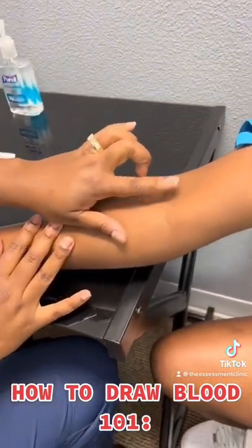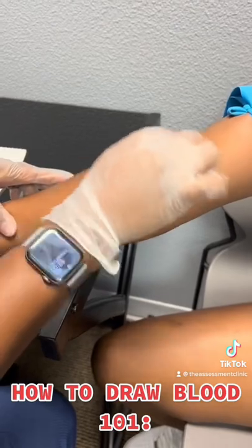Make sure it's nice and bouncy. Clean the skin with alcohol, then let it dry.